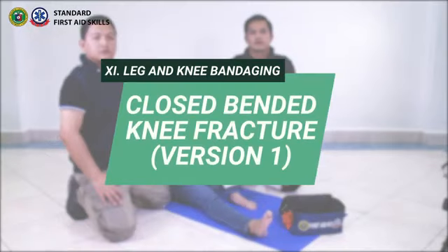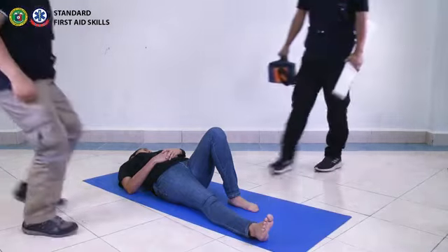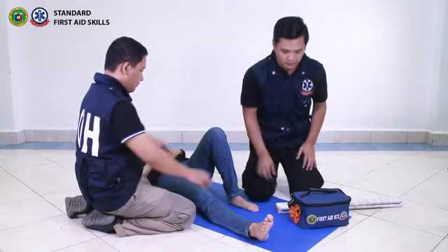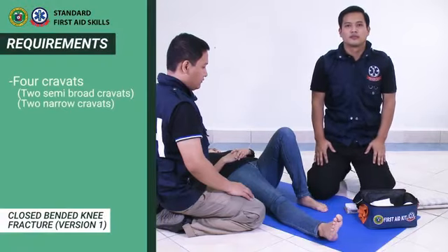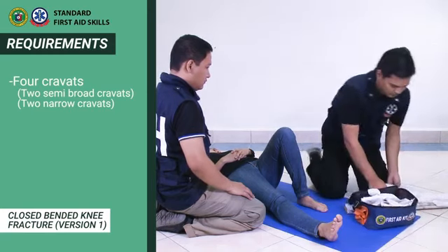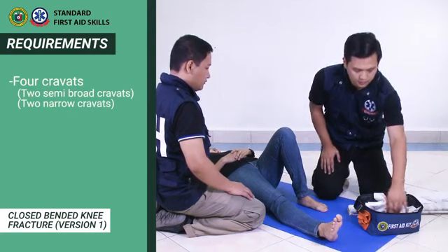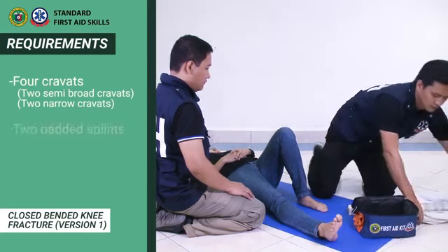Closed Bended Knee Fracture Version 1. This technique is applied in stabilizing a knee fracture in closed-bended form. It involves two rescuers: the second rescuer to assist in stabilizing the injured limb, and the first rescuer to apply the bandages and splints. There is a need for four cravats consisting of two semi-broad and two narrow, and two padded splints.